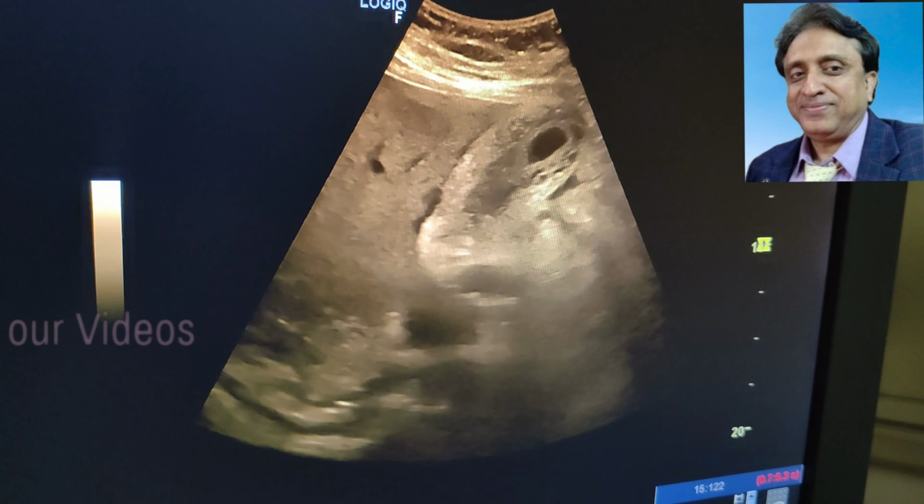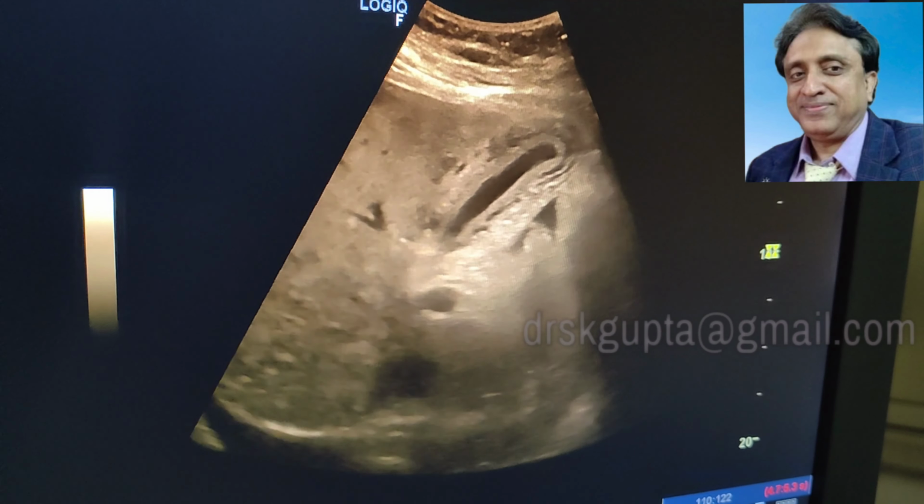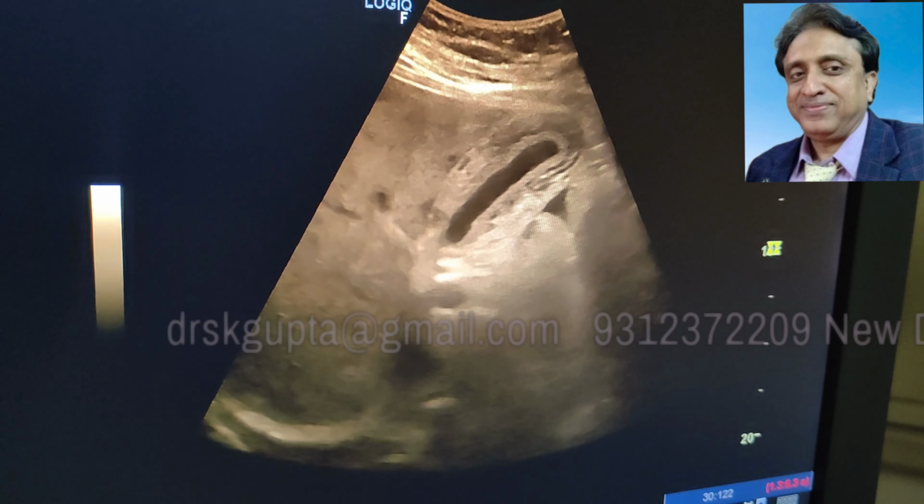I hope we have been able to demonstrate a good case of dengue fever with all the radiological findings in a serial manner.